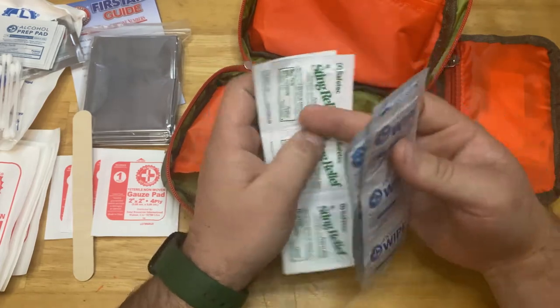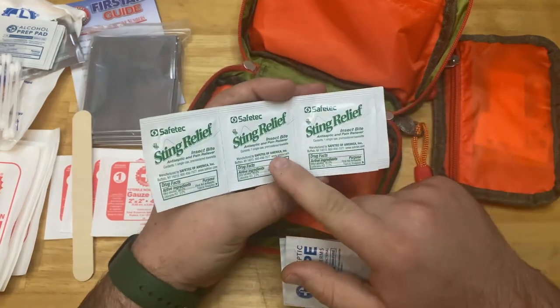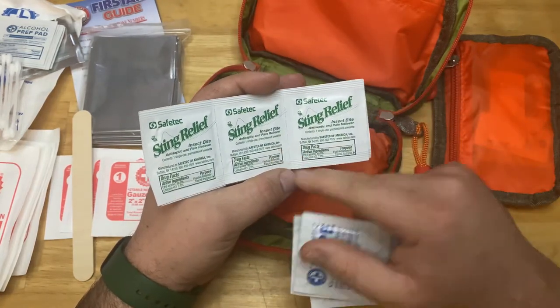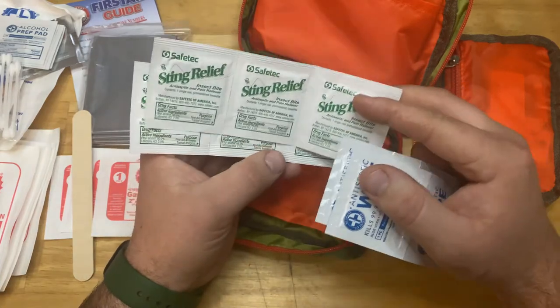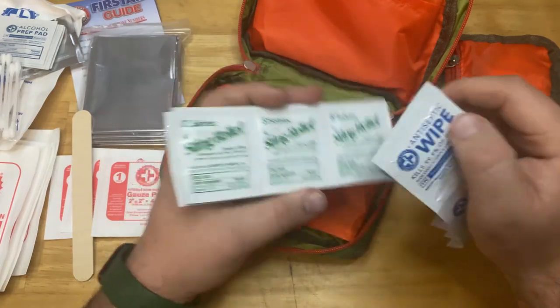We have six sting relief pads. If you've ever been stung, you know that can get very irritating, so these definitely help alleviate some of that pain and irritation. They contain alcohol and lidocaine.